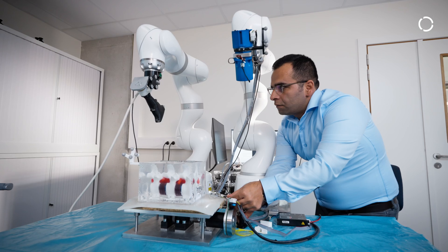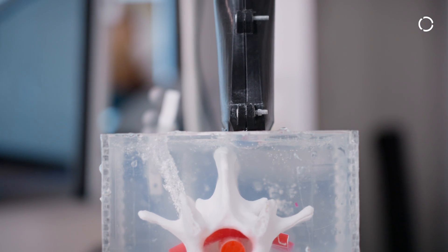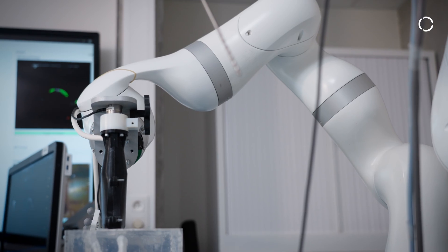Traditionally, surgeons place the screw blindly, or if unsure, use some kind of X-ray or CT imaging technology to place the screw. But we are relying on the ultrasound as a non-radiation technology. We revolutionize this current surgical performing by ultrasound-guided drill implant system.